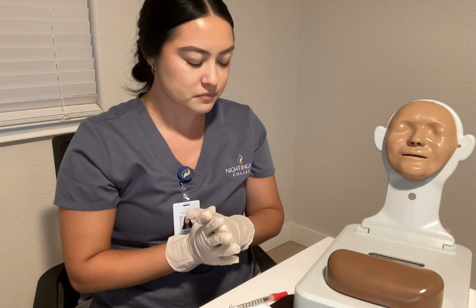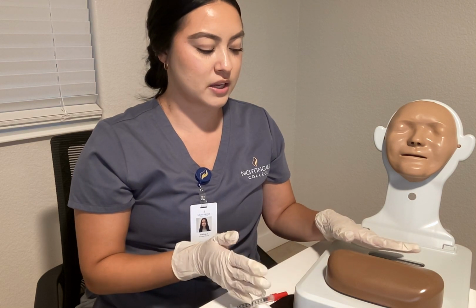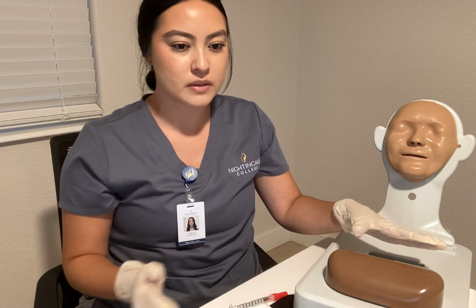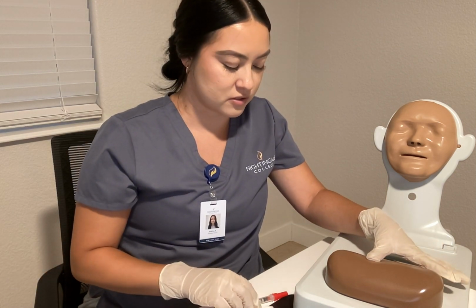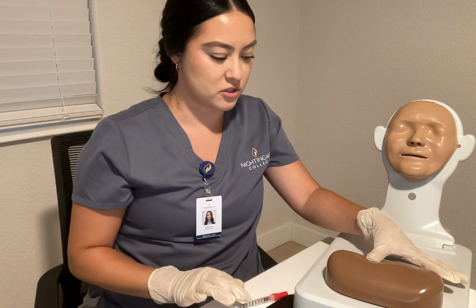So next, after it's dried, we can go ahead and taut the skin, or just putting some resistance onto the skin. We're just stretching it. So I'm going to go ahead and do that. Once I've identified my space, I like to just pull down. Again, I have my gauze nearby and then my injection ready.